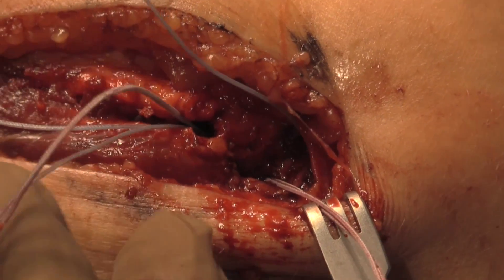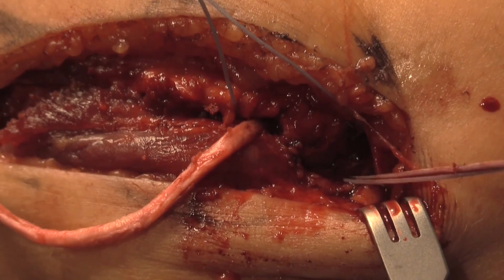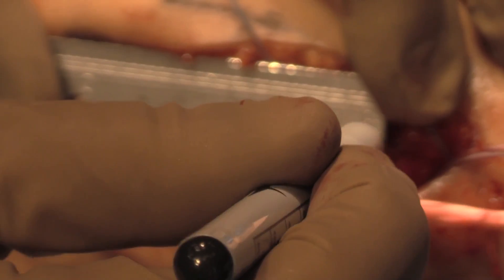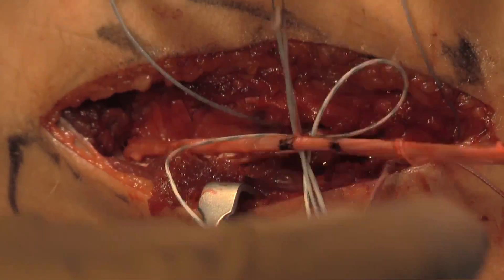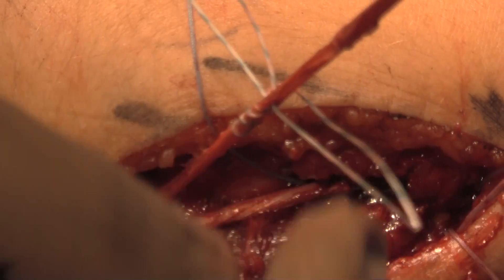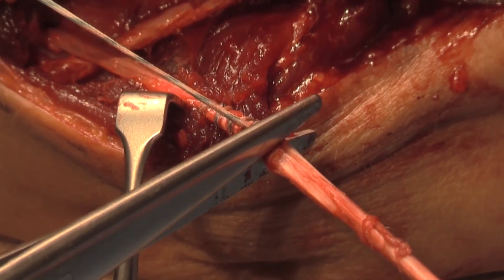After this is completed, one limb of the graft is then passed and docked into the tunnel. The other limb is shortened, and with the tunnel being drilled 15 millimeters, we are able to determine the appropriate level where the graft should be cut and where 15 millimeters of graft will be docked into the tunnel. A passing stitch is placed in a Krakow-type fashion using a fiber loop. After this is passed, the graft is then cut at the desired level, and we determine the appropriate tension and confirm our length determination.